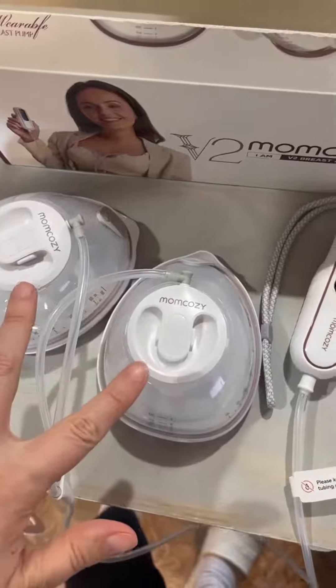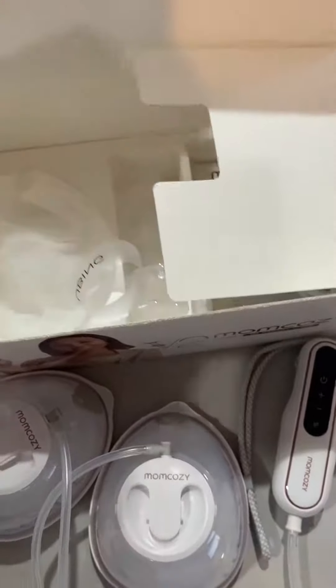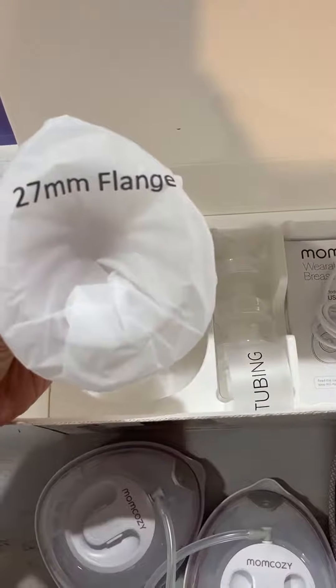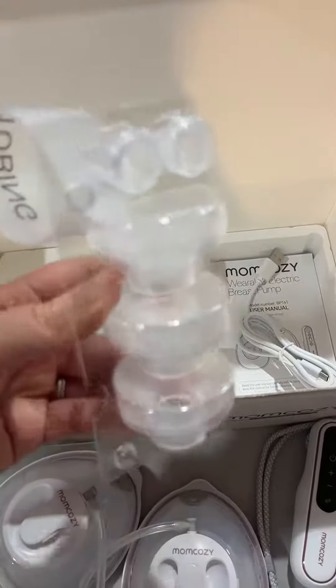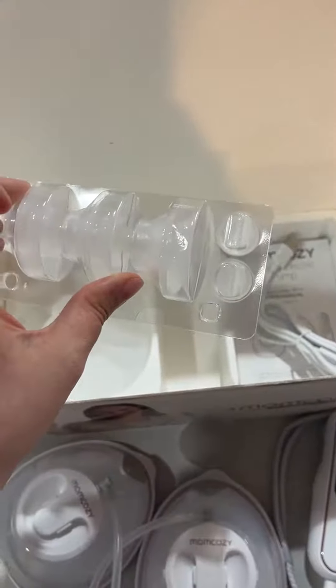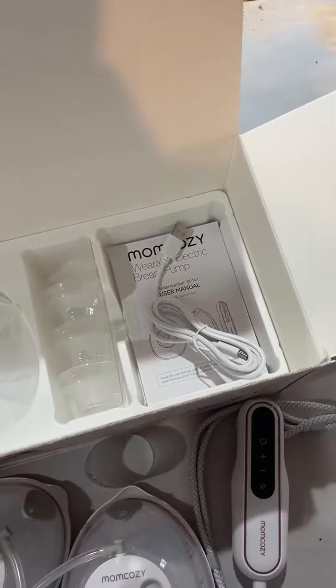Outside of getting the breast pumps themselves, they actually do give you a lot of different accessories. One thing that I really like about Mom Cozy is they're really great about providing you extras so you don't have to reorder. You get some additional flanges — these parts actually go inside of the breast pumps themselves, and you get some additional ones because sometimes they can get kind of gunky after a while. And then of course you have your charging cord and also your user manual.